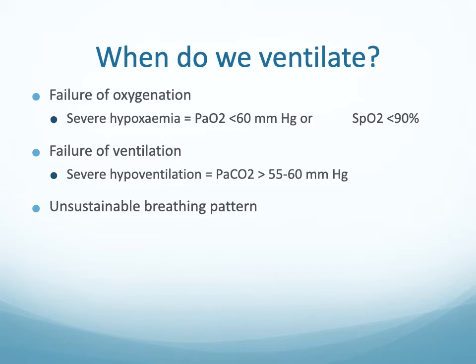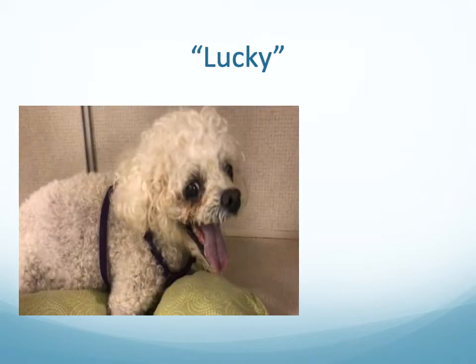So even with your normal blood gases, normal oxygenation, if a patient is breathing in this pattern, they are going to fatigue very quickly, and that's a very important indication for ventilation.